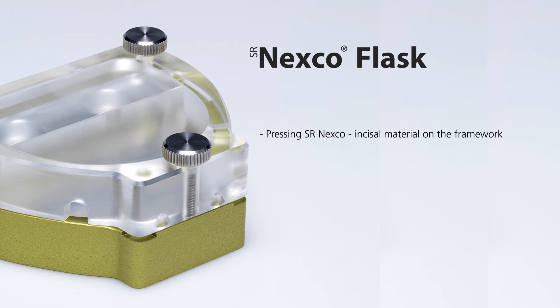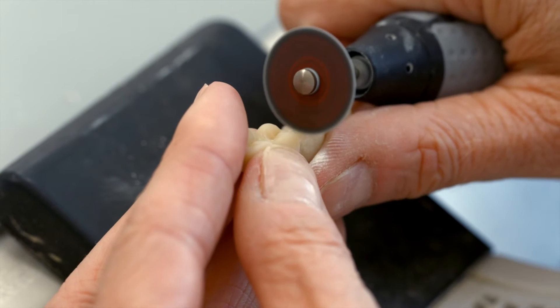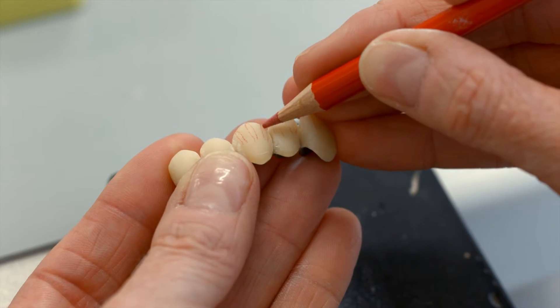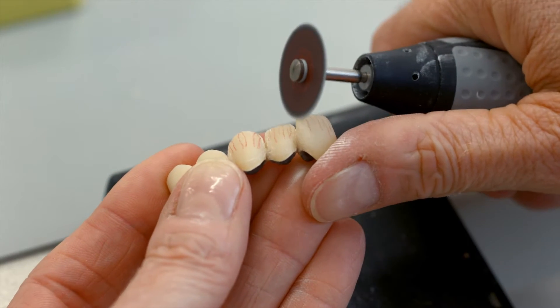Part 5. Pressing SR-NEXCO incisal material on the framework. Cut back the pressed-on dentin in order to accommodate the incisal material. Use rotating instruments, for example, tungsten carbide burrs or separating discs.